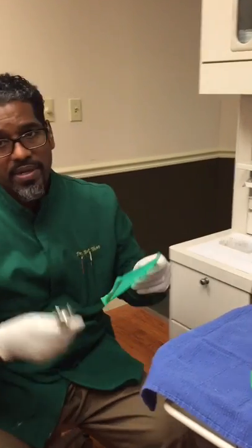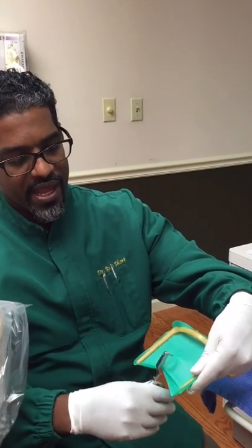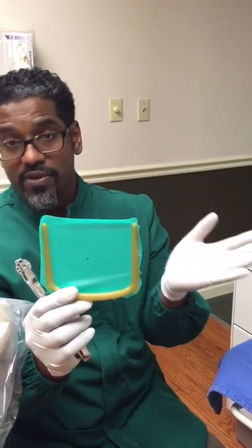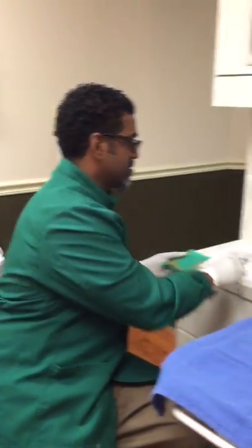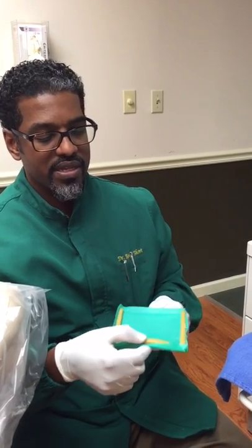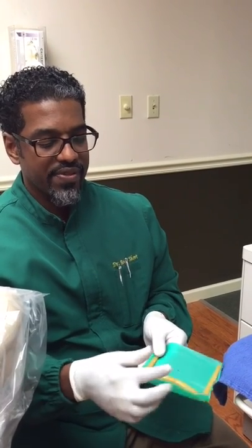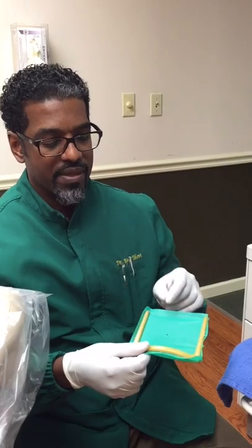Then use your rubber dam punch, and when you punch it, you want to make sure you punch it right in the center. The cool thing about punching it in the center is that it's a universal punch — you can use it for lower and upper teeth. For the lower teeth, it goes straight down, just like you would see it here, and this bow represents the chin rest. So you put that on the chin and it will be properly angled.